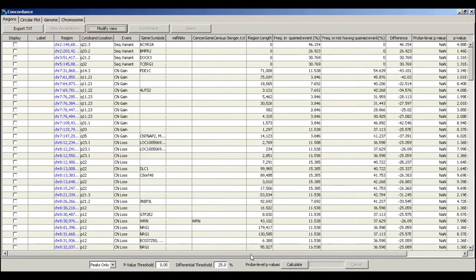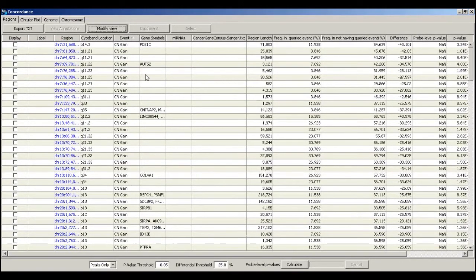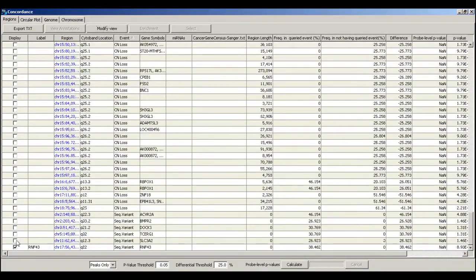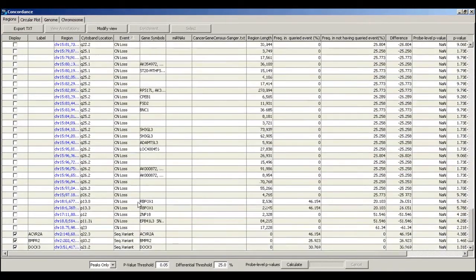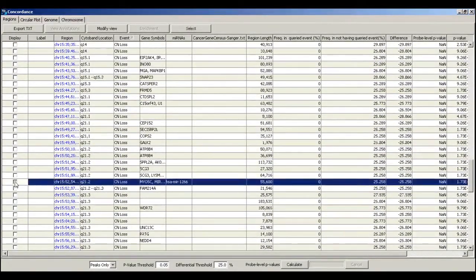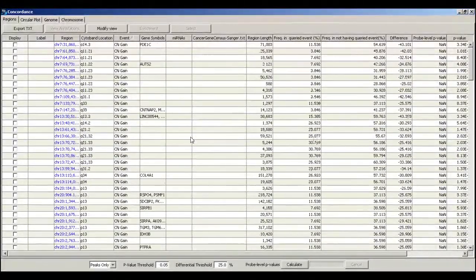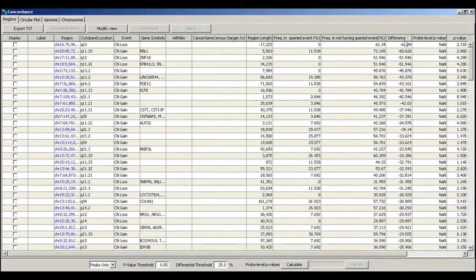Okay, and now I'm going to select areas of interest. So first I'm going to sort based on the event, and I want to select all of the mutations that co-occur with BRAF hotspot mutations, because I think that's pretty interesting. I'm also interested in any microRNAs that co-occur and any cancer genes that co-occur. Okay, and next I want to actually sort based on this differential. So I'm really interested in any changes that are occurring at a very high differential frequency, greater than 50%.